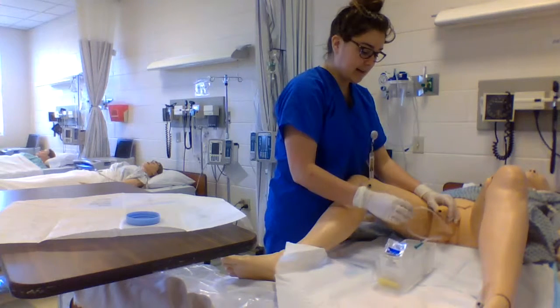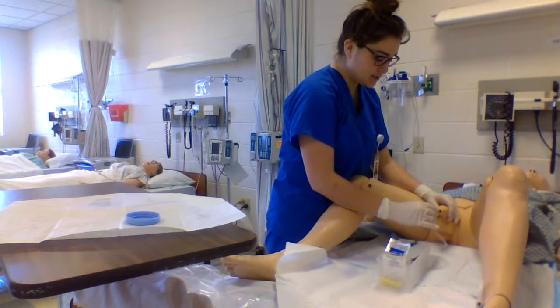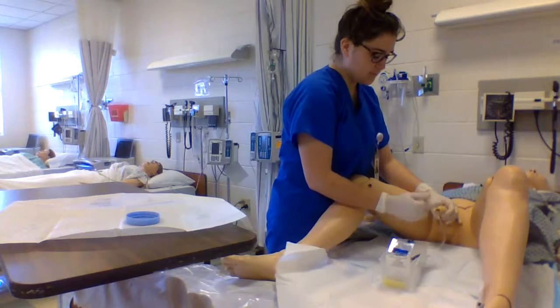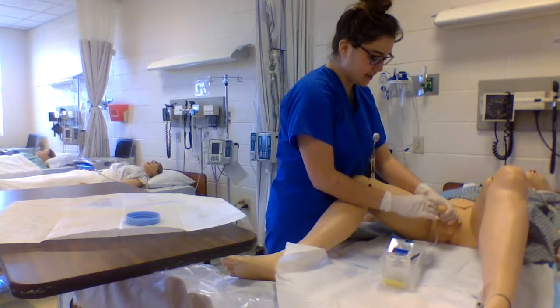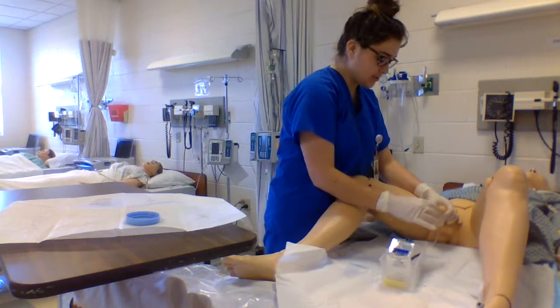So I'm going to go ahead and get my catheter and I'm going to insert it into the penis, into the urethra. I'm going to extend the penis straight, and then I'm going to insert the catheter. So the urethra straight. Once I go past the prostate, I'll go past it just a centimeter or two.